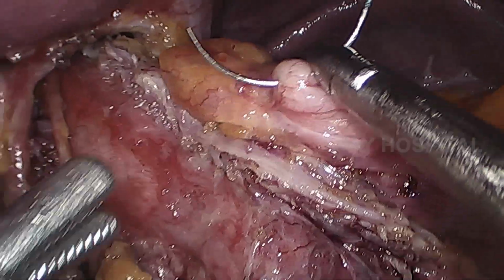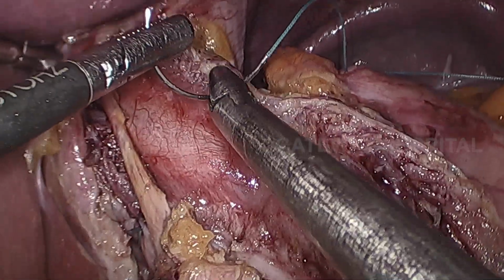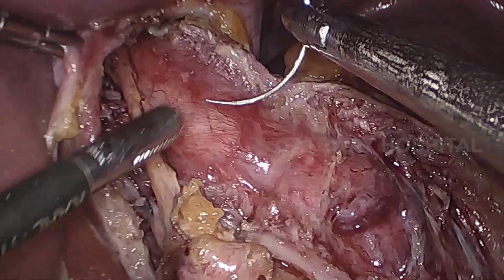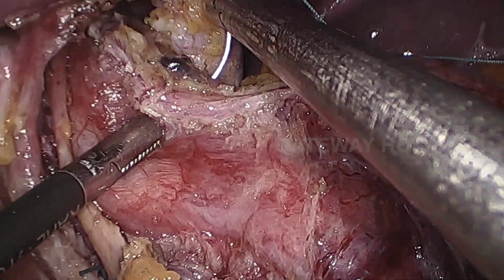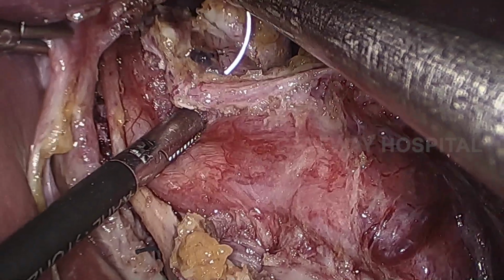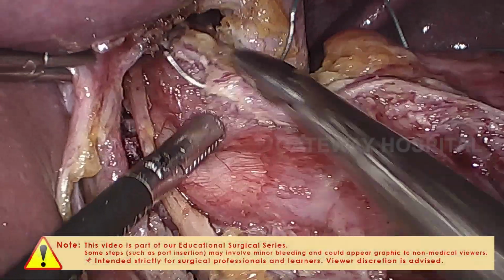We have gone to the left side. We are taking the fundus of the stomach to the left side cut end of the muscle fiber. Again we place around 3 or sometimes 4 sutures.